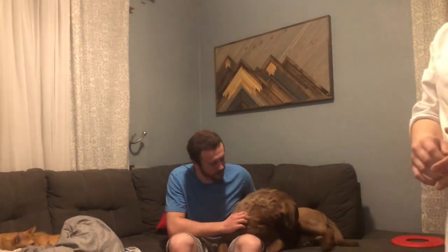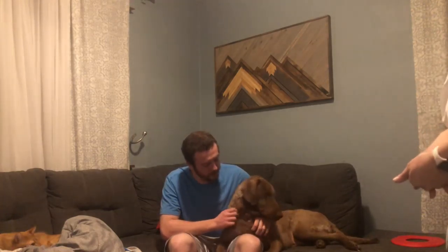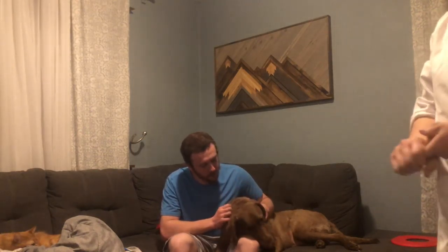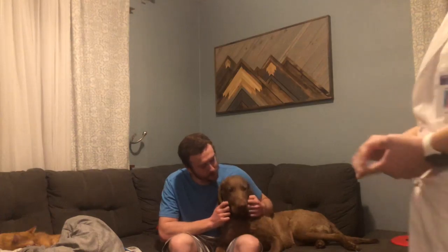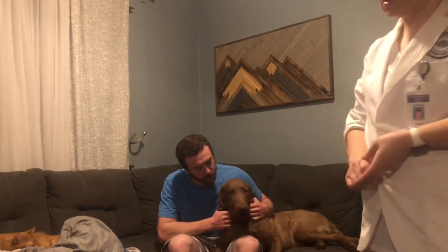My name is Lizetta Pruitt. I'm going to be performing an oral throat swab today on my patient. To start, I would check my provider's order for an oral throat swab. I would review my policy and procedures. I would gather my equipment needed. I would check the integrity of my equipment, making sure that they are unopened and not expired.